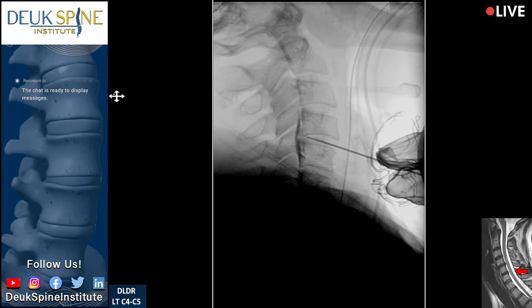Often when people get angry or excited because they have valsalva, all the blood from their head slows down going back to the heart. This is a superficial vein just under the skin — impossible to avoid or predict. We're just going to hold pressure for a minute while it clots off.